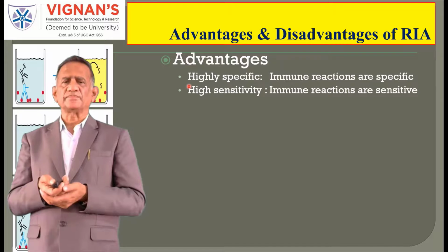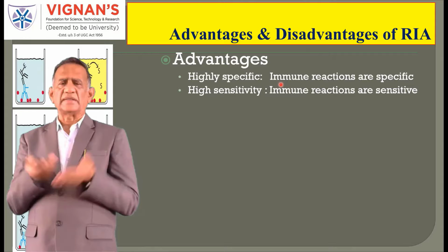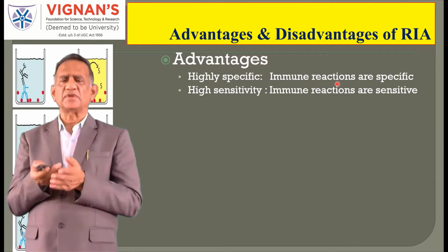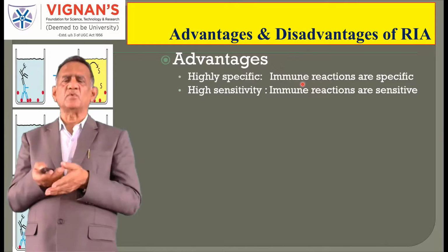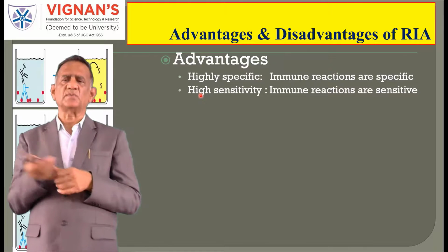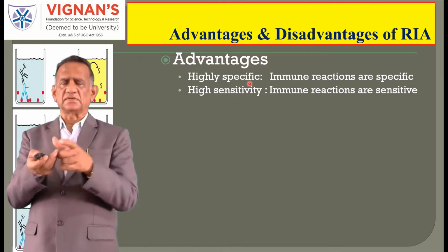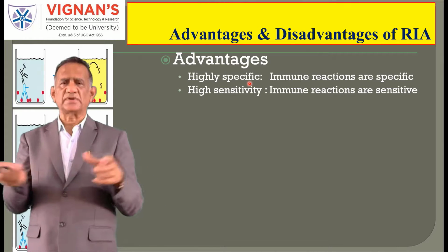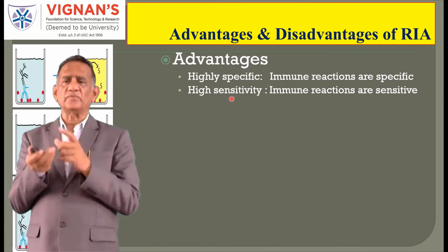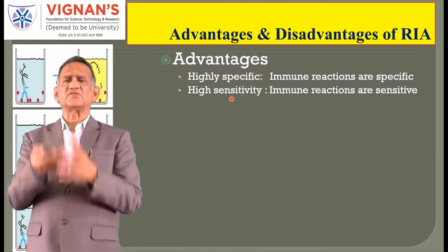Usually, in those days, for mothers who were unable to conceive babies, the estrogen concentration in the blood serum, the hormone estrogen, had to be measured. For the estimation of that hormone, we did not have any device. We used to go for RIA either to Madras or to Bombay to give our samples to estimate through scintillation counters, Geiger-Muller counters. So those were the techniques. Now that is improvised and simplified in ELISA so that in nooks and corners we can estimate the estrogen levels.